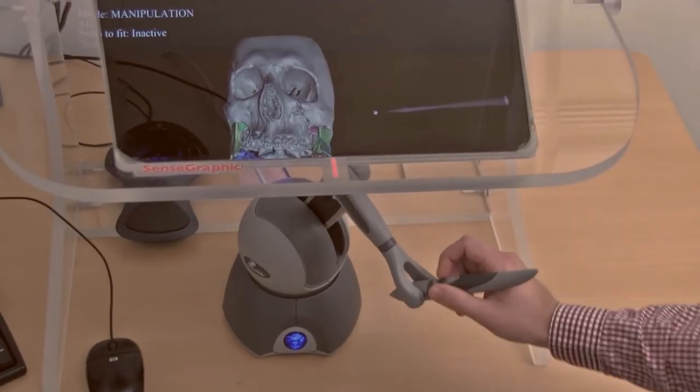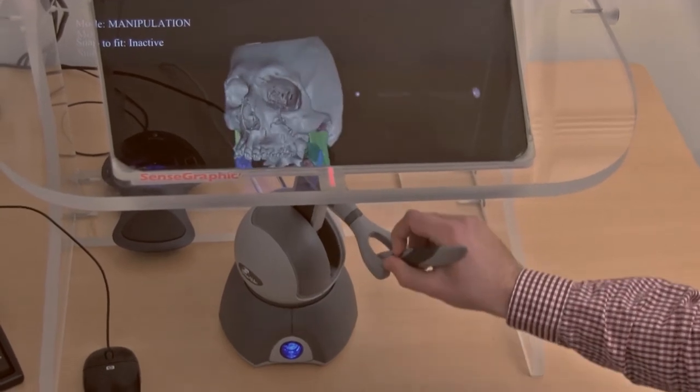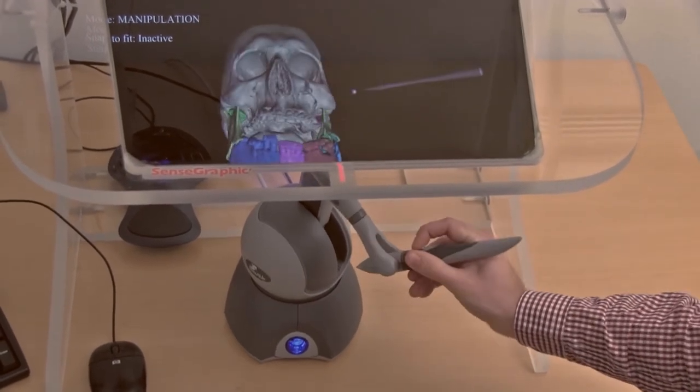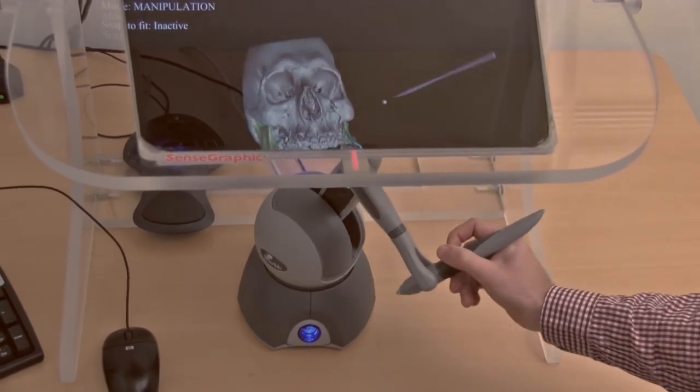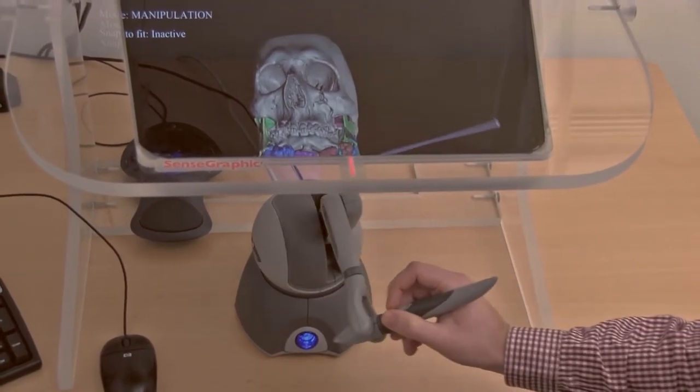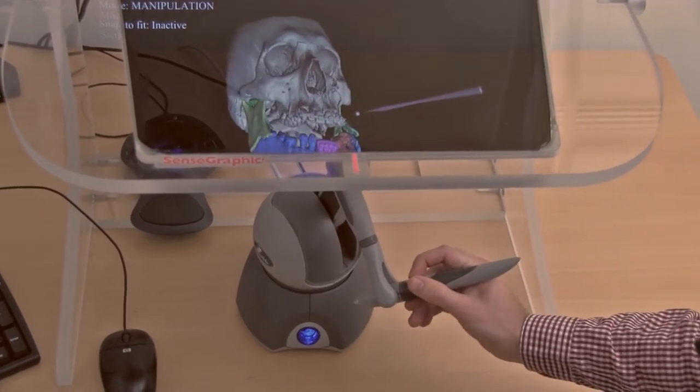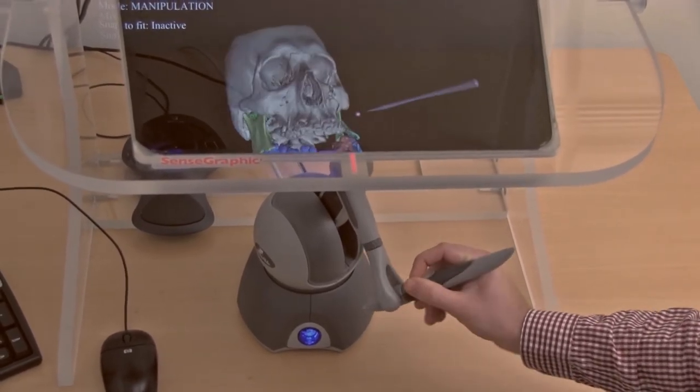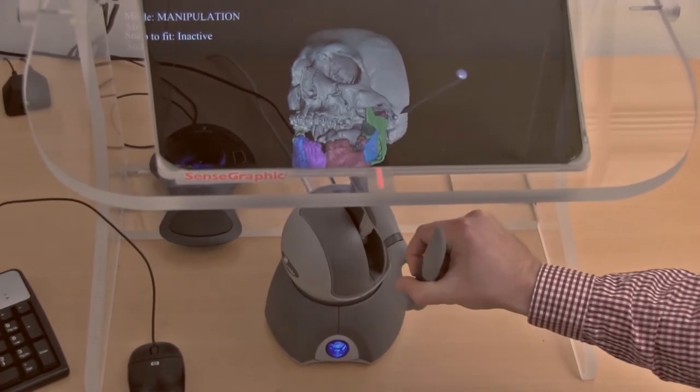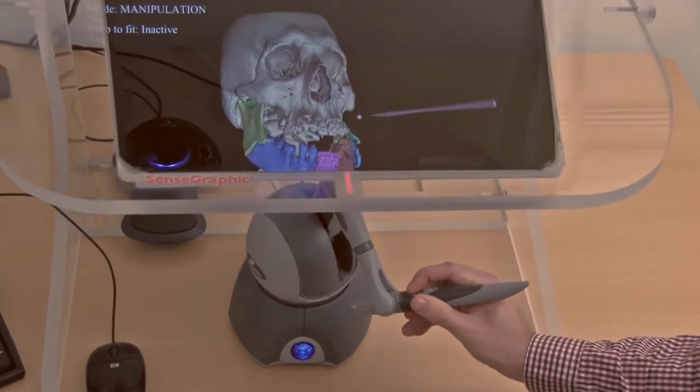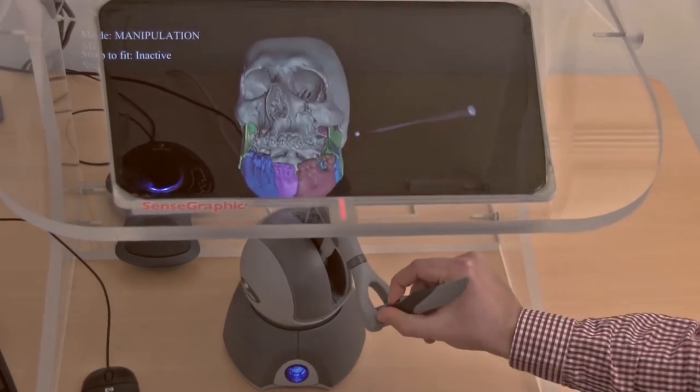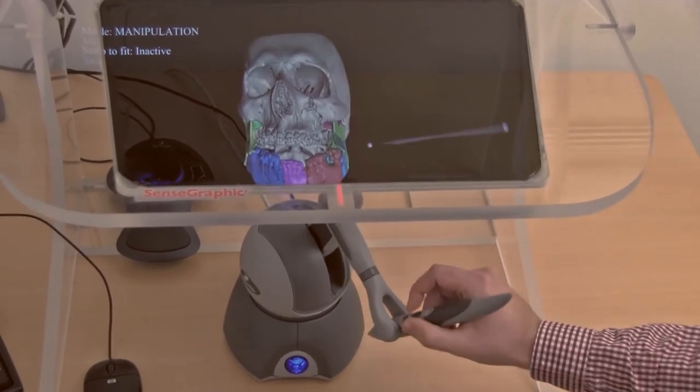So basically what we're seeing here is a 3D model derived from computer tomography images from a patient with a complex fracture to the jaw. And when you think of it, this is really a 3D puzzle that needs to be solved by the surgeon ahead of surgery. So a big part of the planning step is to figure out how these pieces really should fit together.